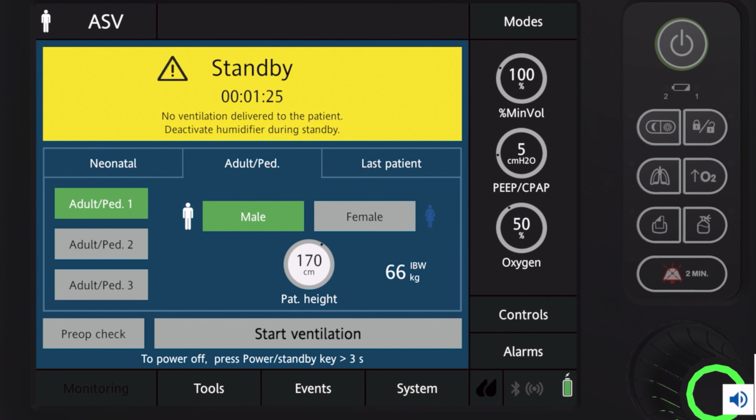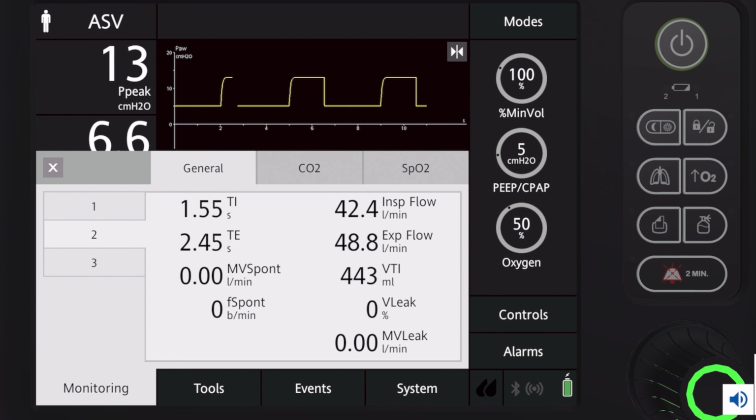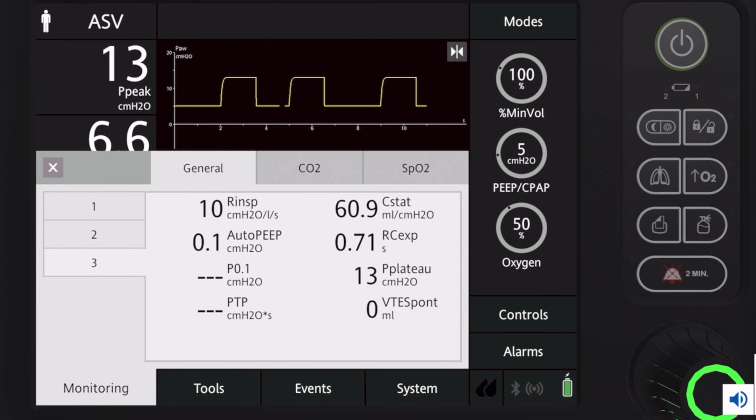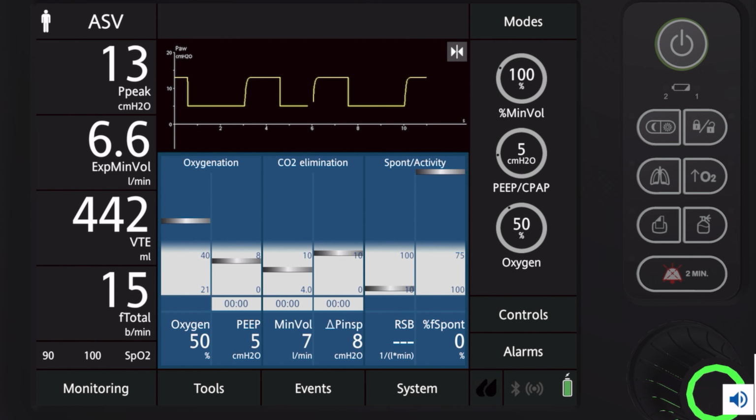As a side note, in adaptive support ventilation, the T1 leverages the power of the AI integrated ventilation mode. The ventilator determines the ideal combination of frequency, tidal volume, inspiratory to expiratory ratio, inspiratory time, and other parameters to ensure safe and comfortable mechanical ventilation for the patient.